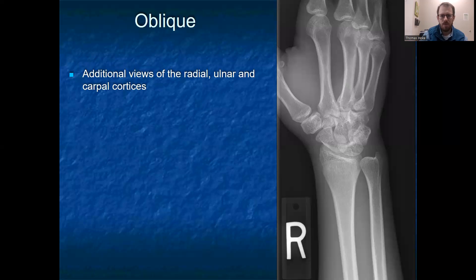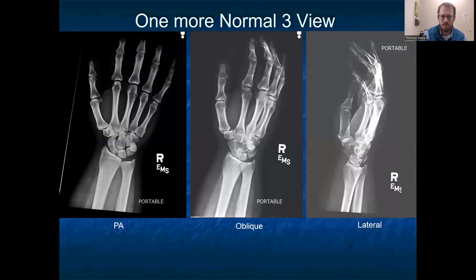The last of the typical three views is an oblique. This is an additional view of the radial, ulnar, and carpal cortices so you can pick out subtle irregularities that might not show up on your initial two-view. Note that films that are overexposed or have incomplete overlap of the radius and ulna on the lateral are not true laterals.